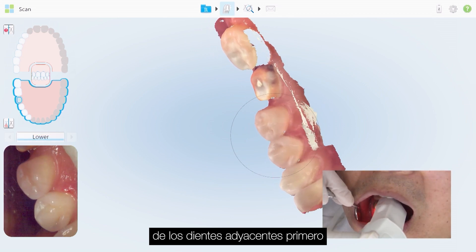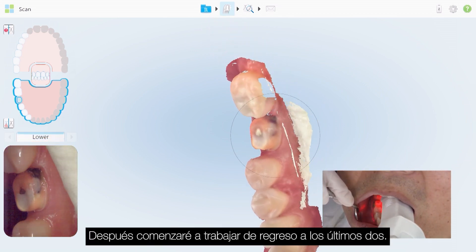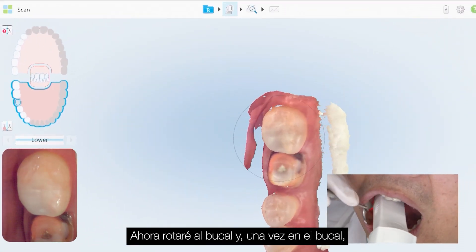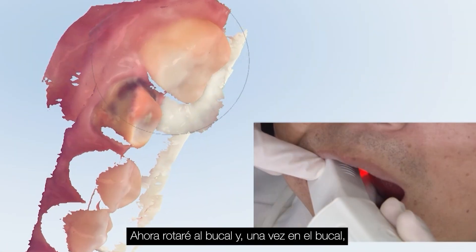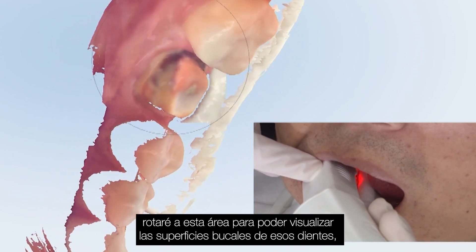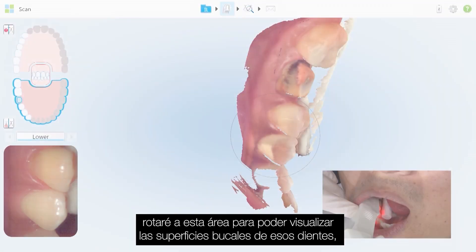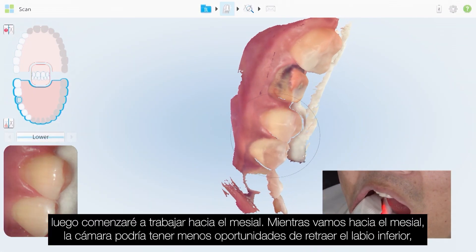Now we'll capture the lingual surfaces of the adjacent teeth first, then begin working my way back to the last tooth. Then I'll rotate to the buccal, and once I rotate to this area I can visualize the buccal surfaces of those teeth, and I'll begin working my way toward the mesial.